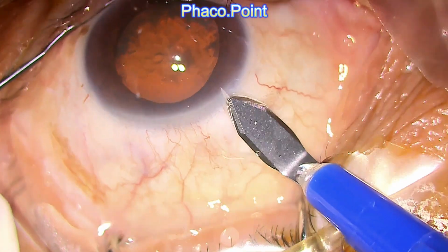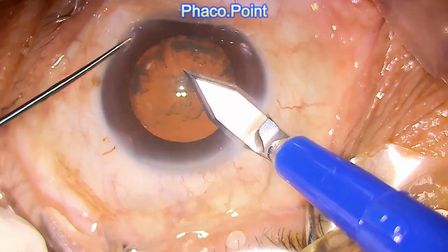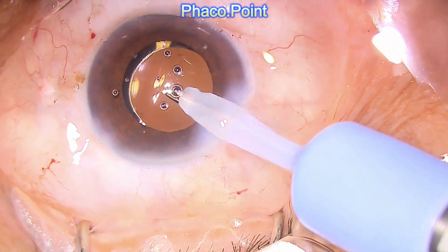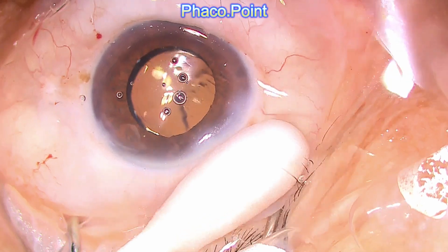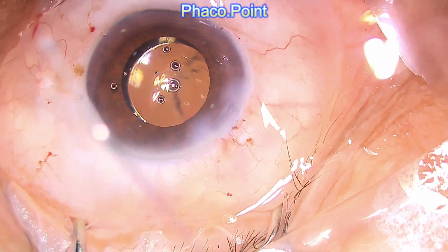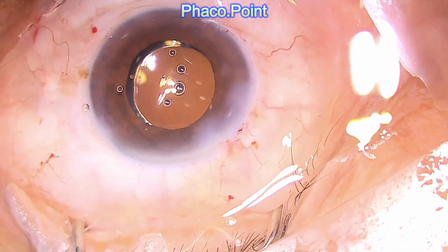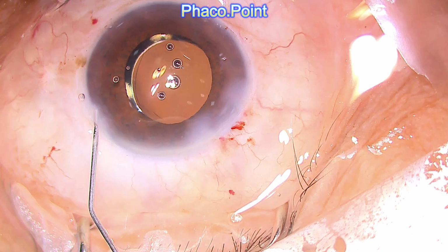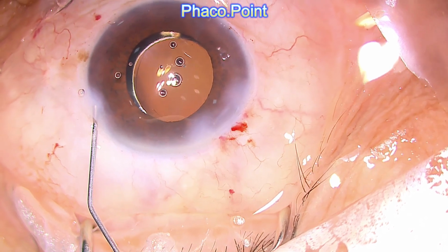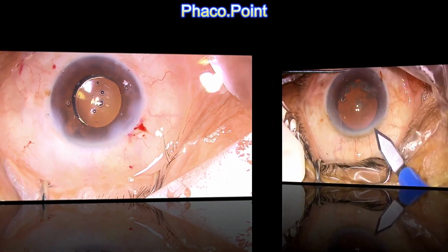First, the creation of the clear corneal incision. It is done quite perfectly in this case, and now let's move on to the end of the case. While pulling out the coaxial IA probe, I'm gently pressing on the main corneal incision. Now watch carefully as I inject small amounts of balanced salt solution and see what happens to this area of the clear corneal incision. There is definitely an increase in the stromal hydration that occurs as I inject the fluid, and this will seal the clear corneal incision.